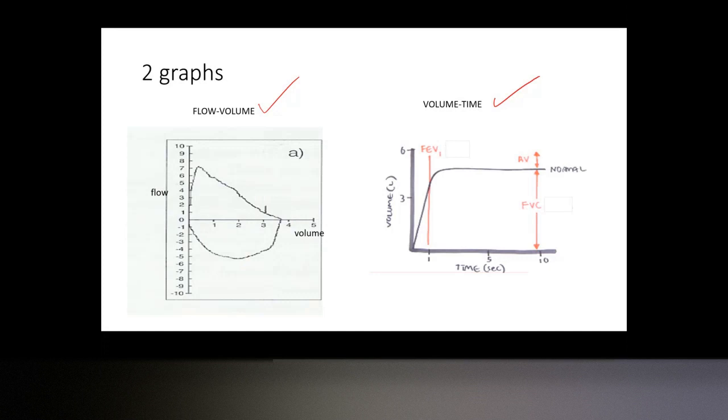Volume time, it's the graph that again, so in this one, it represents the expiration and the inspiration. But in this one, this is again the same result, but in a different form. So it's volume time. In this, we don't need the inspiration, we take the expiration.